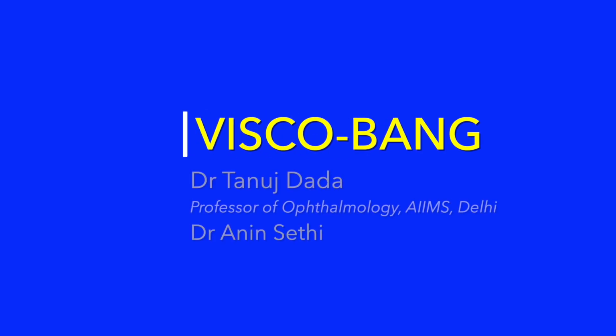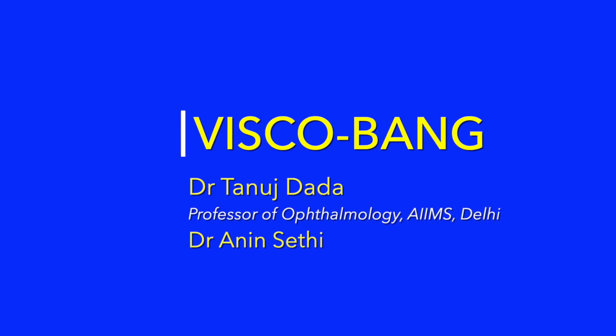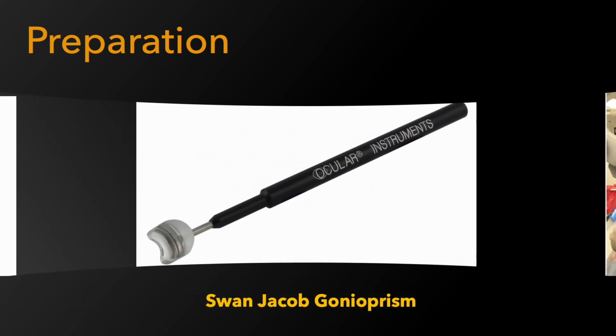In this video, we demonstrate bent ab interno needle goniectomy assisted by visco-dilation of the Schlemm's canal, also labeled as Visco-BANG. This procedure may be performed in conjunction with phacoemulsification cataract surgery or as a standalone procedure. It is preferably performed under peribulbar anesthesia, which prevents any inadvertent movement of the patient's eye.